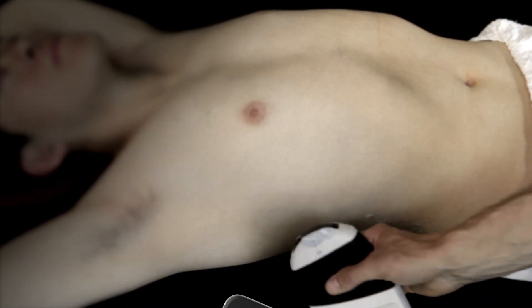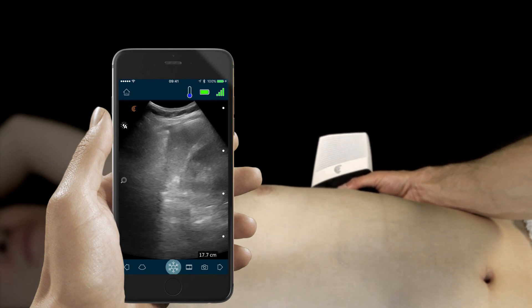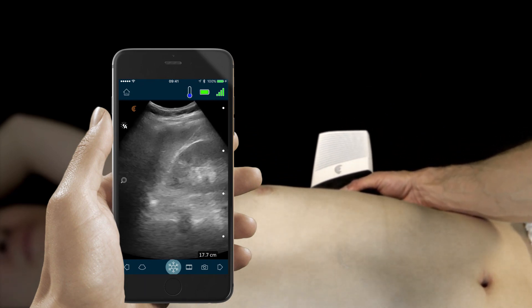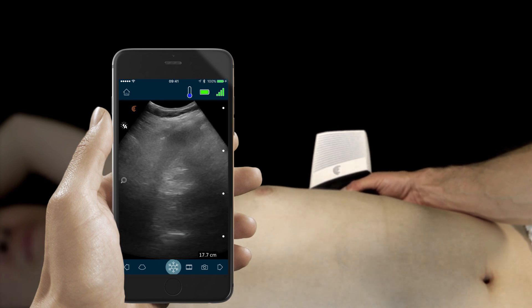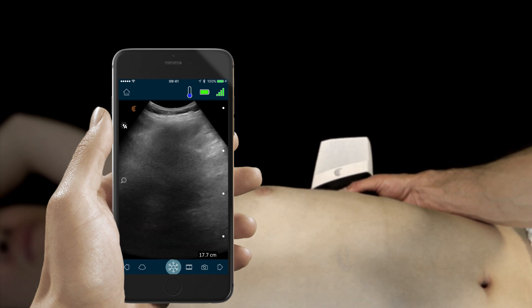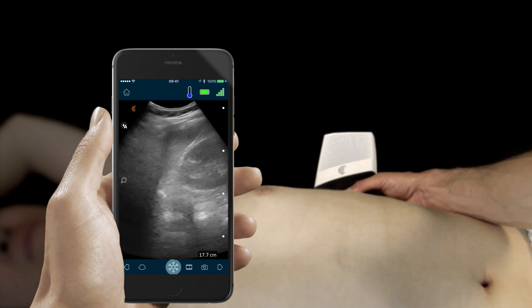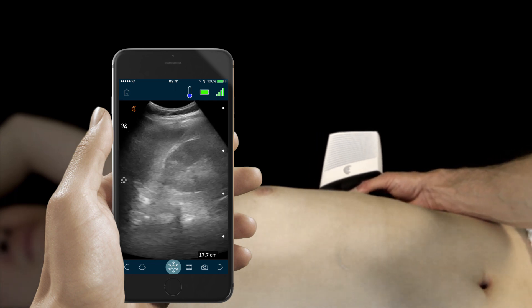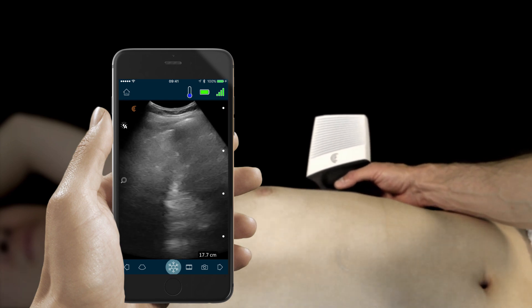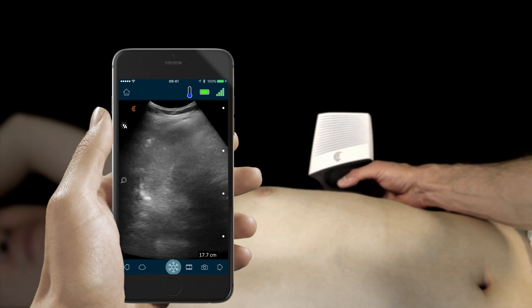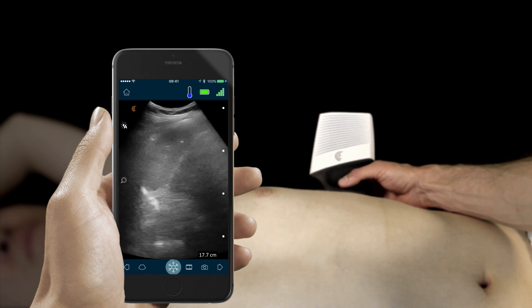For the next part of our FAST examination, we're going to examine the left upper quadrant, looking for any sign of free intraperitoneal fluid. We'll use the spleen as our acoustic window to visualize the space between the spleen and the left kidney. We want to make sure that we can see the inferior tip of the spleen as well. Finally, we want to make sure that we can see the interface between the spleen and the diaphragm from 6 to 9 o'clock.